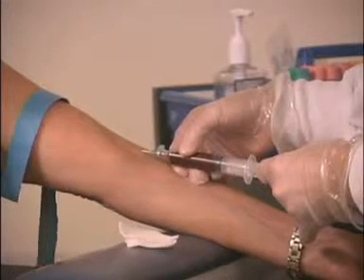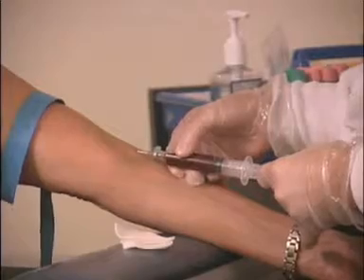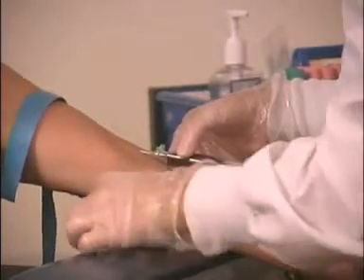It must be filled by slowly pulling back on the plunger with your free hand. Steady the syringe as you would an ETS holder during routine venipuncture.